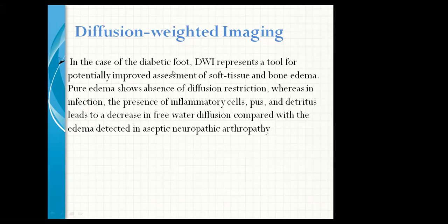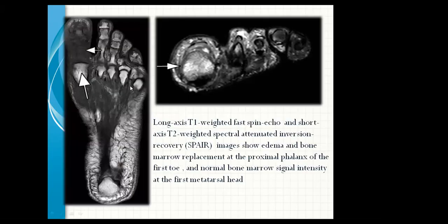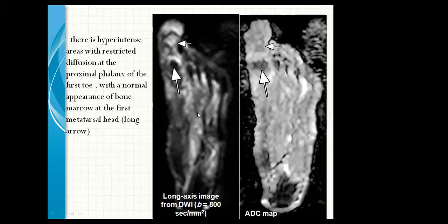Diffusion-weighted imaging. In the case of diabetic foot, it presents a tool for potentially improved assessment of soft tissue and bone edema. Pure edema shows absence of diffusion restriction, whereas in infection, the presence of inflammatory cells, pus, and debris leads to decreased free water diffusion compared with the edema detected in aseptic neuroarthropathy. A DWI b800 and ADC map show a hyperintense area with restriction diffusion at the proximal phalanx of the first toe, with normal bone marrow signal intensity at the first metatarsal head.